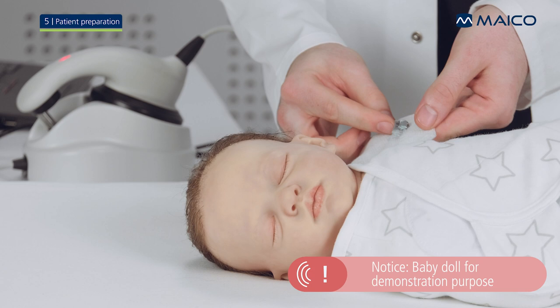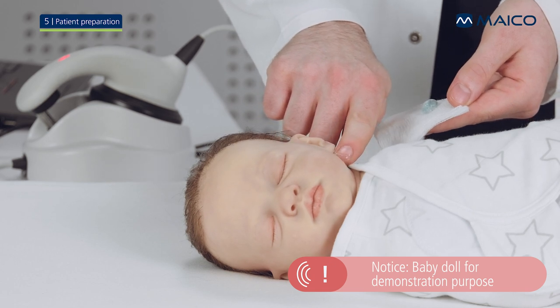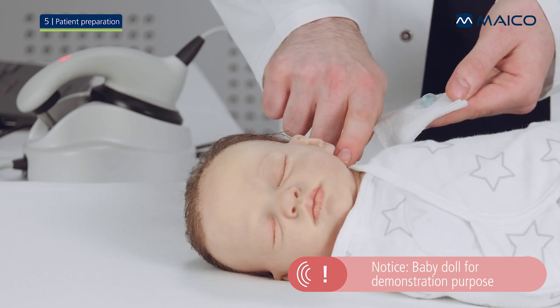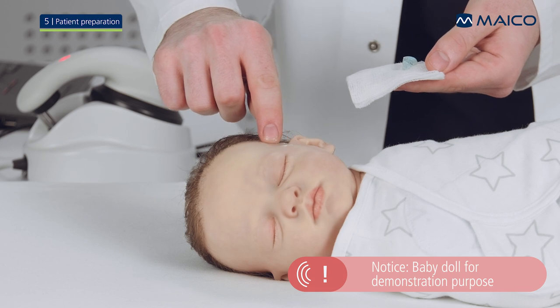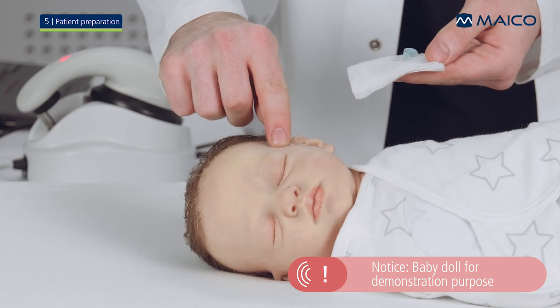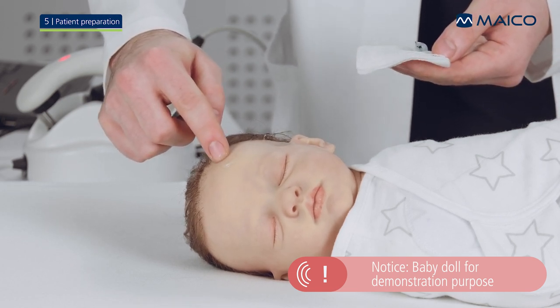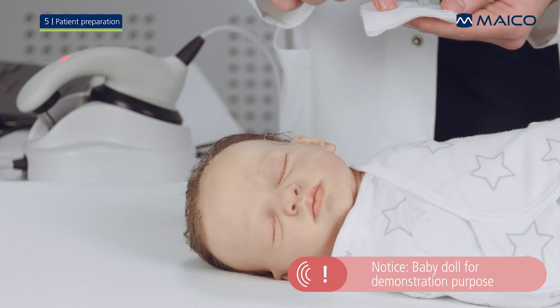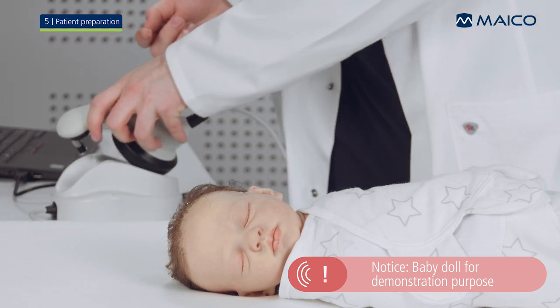Place a small amount of electrode gel on the tip of your finger. Massage the gel gently into the skin at the electrode spots 10 to 15 times. Be sure that the gel from one location does not mix with the gel from another spot. Finally, place a small amount of gel on the electrodes of the Barafone.